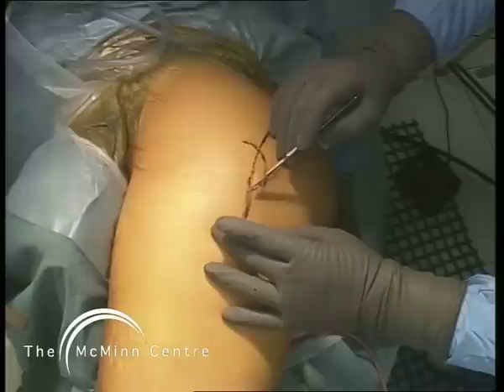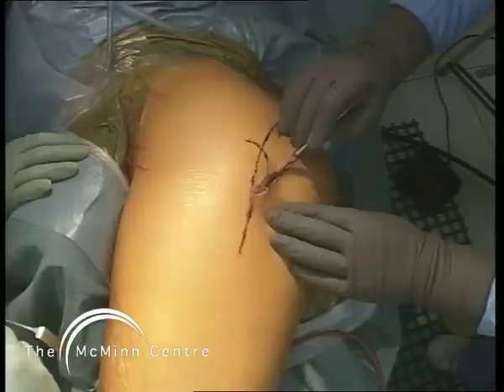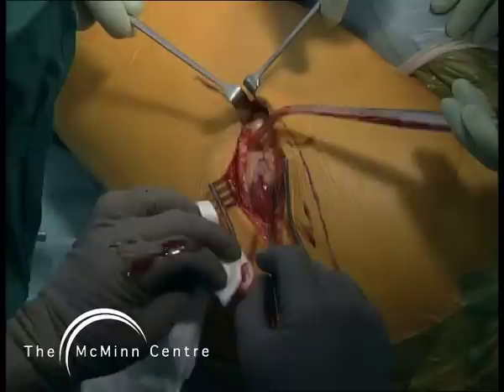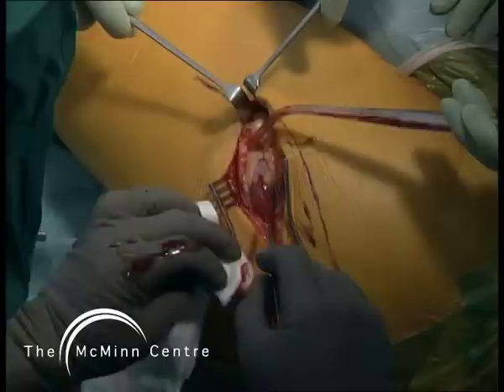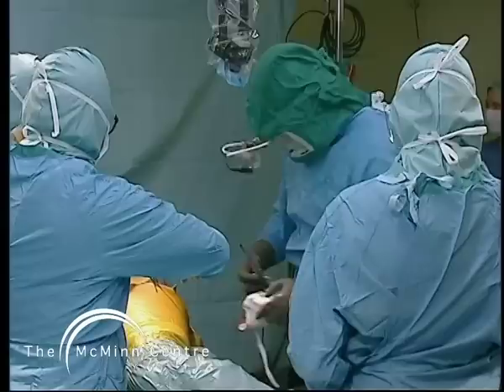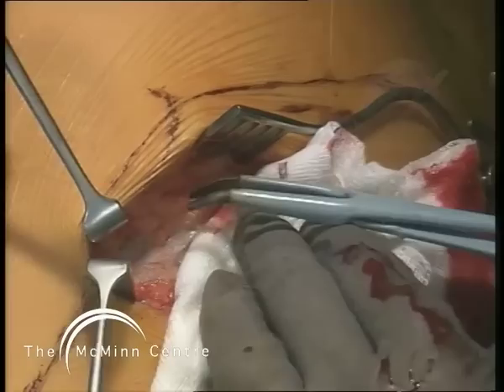I'm making my incision 11 centimeters along that line and now deepening through the fat layer. We'll put in a retractor and start coagulating vessels. I have more problem with bleeding in the fat layer than in the deep layers, so I'm fairly careful about coagulating all small vessels. You can see the fibers of gluteus maximus being exposed as we clear fat over their attachment to the fascia lata.